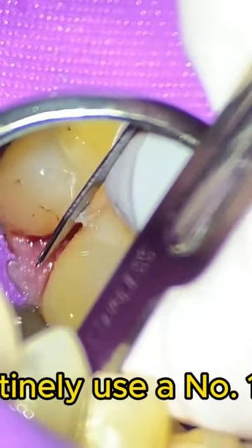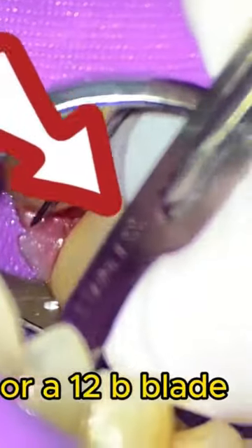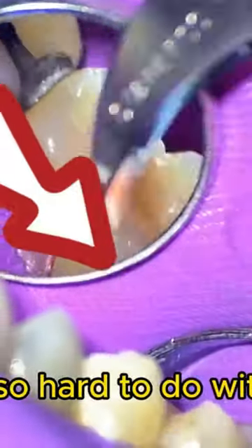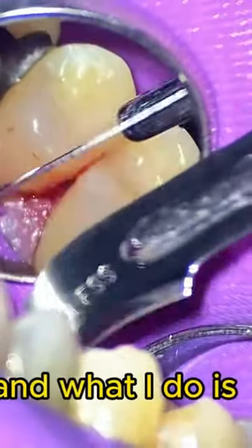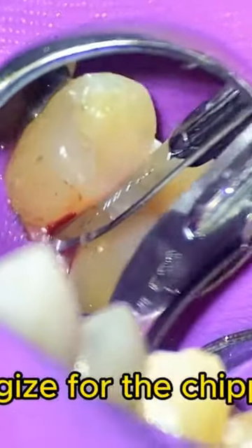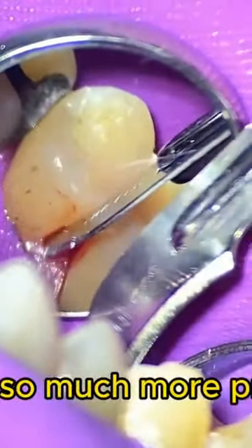I now routinely use a number 15 blade, which you're seeing here, or a 12B blade to create that subtle feature, which is so hard to do with burrs. I tell the patient that I'm doing some fine detail work and I apologize for the chipping noise, because it is a chipping noise that's going on, but it's so much more precise.